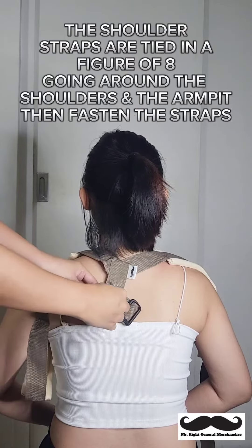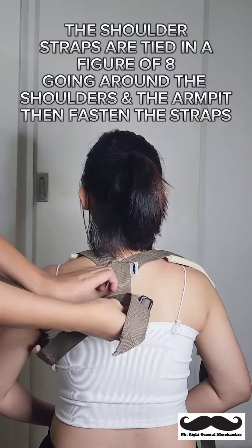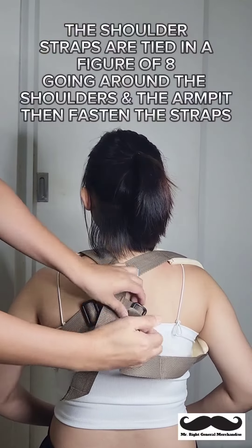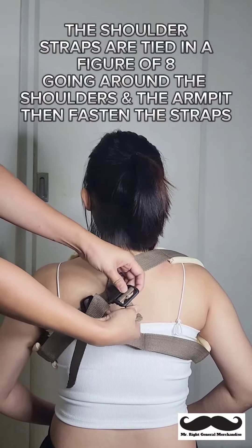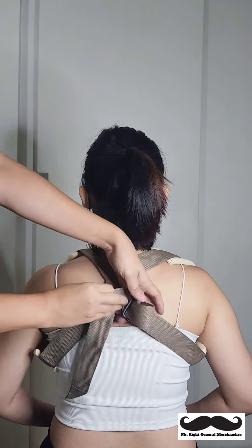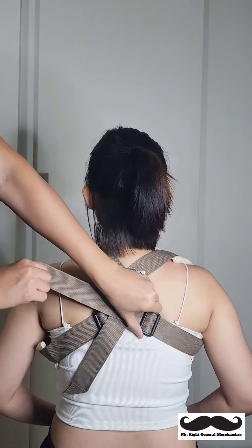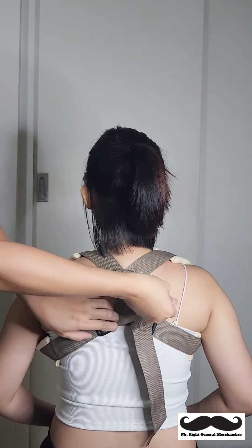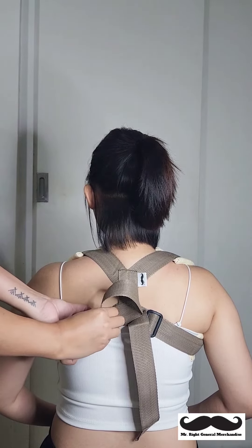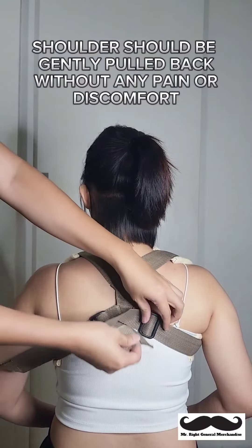The shoulder straps are tied in a figure of eight. Go in around the shoulders and the armpit and fasten the straps. Shoulders should be gently pulled back without any pain or discomfort.